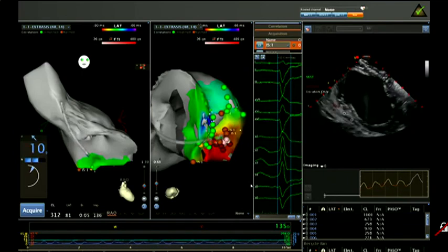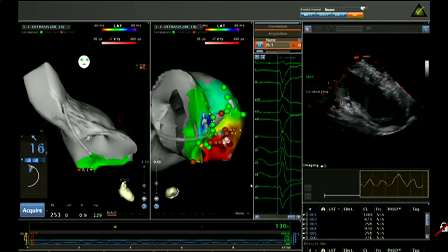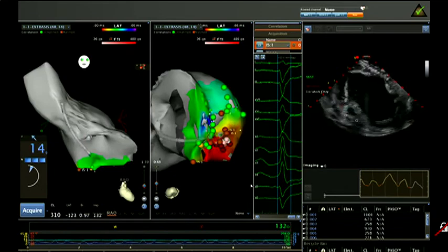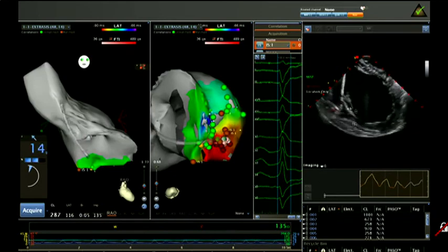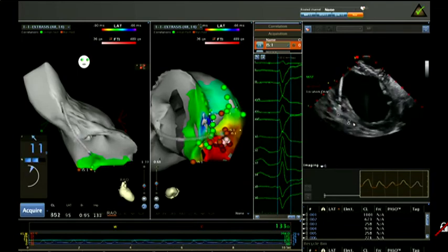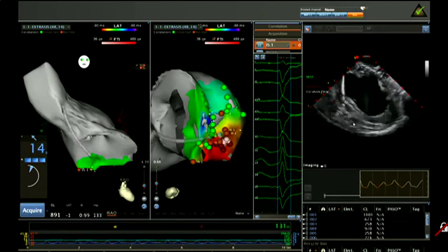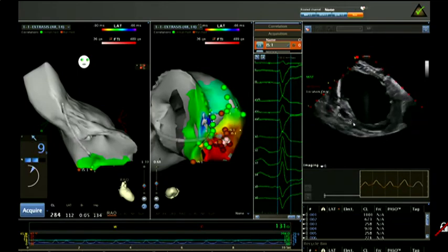How do you differentiate if you are in the papillary or in the other area? This is the visualization of the tip of the ablation catheter. You can see the green pointer intermittently, since it's in the root of the papillary muscle. This is where we find first a lot of high frequency signals.